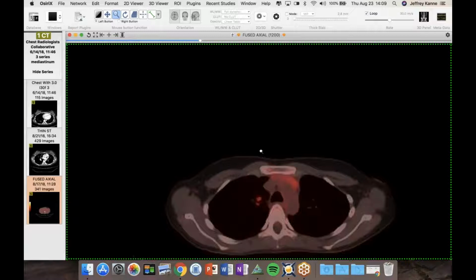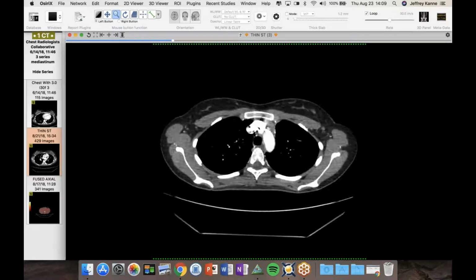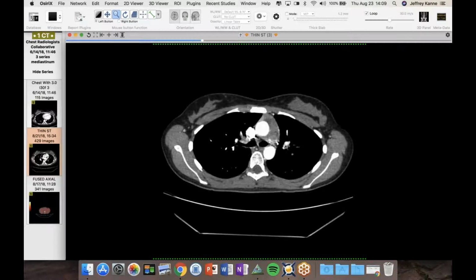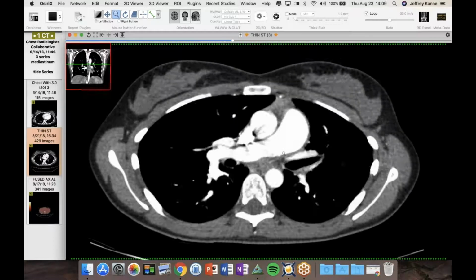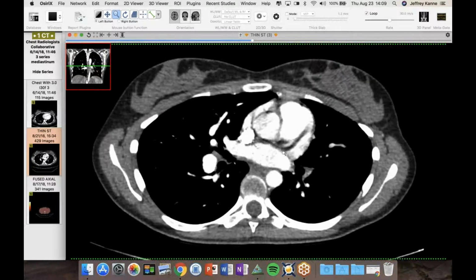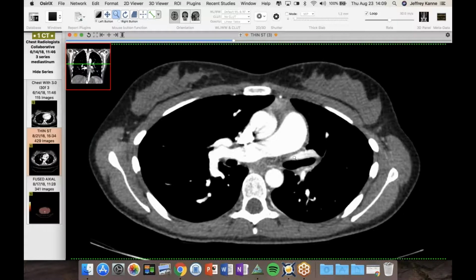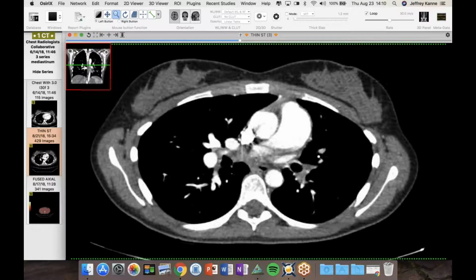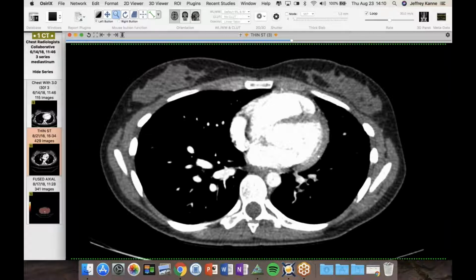So with this upper lobe on the right now, she's having more problems. And so I think they're going to start her on rituximab to try and see if they can stop this process. But it's just an unusual case in that it's bilateral and there's no calcium. And this is presumably from histo. She doesn't have any other causes, but you just see all this collateral flow. For me, that's a little unusual in fibrosing mediastinitis, to have such extensive arterial involvement. But you can see the inferior vein is wide open. The superior vein is a little narrowed, but it's open. So I don't know if anybody had any other thoughts on it, but I think it's a pretty good case for fibrosing mediastinitis.